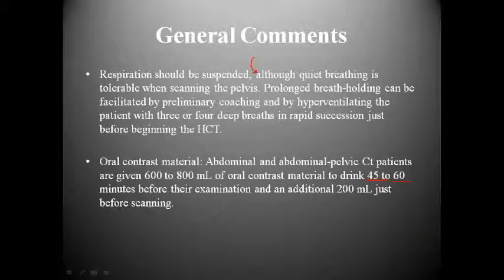The way our facility usually performs our scans is we have 20 milliliters of gastrografin per 600 milliliters of, we utilize basically some diet Kool-Aid. It's artificially sweetened so that we can give it to diabetic patients as well. And we pour our 20 milliliters of gastrografin into this. And so we let them drink this, and then we wait 1 hour.